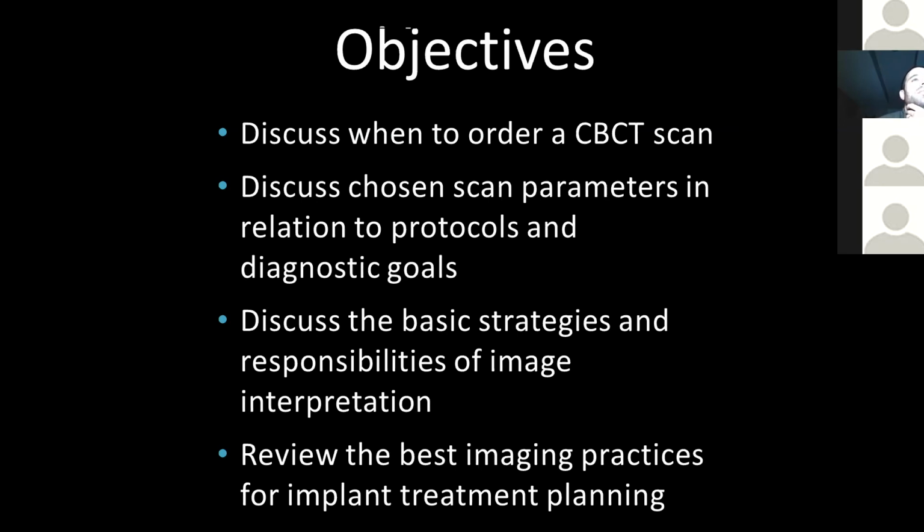There's software packages where you can do some really fun, interesting things where you can mimic or simulate the divergent beams in a traditional ceph, where one side of the face is slightly more magnified than the other. You can also eliminate that and basically create a perfectly ideal beam that eliminates that magnification. Either of those, it's fairly well documented that they are equivalent from a tracing perspective to a traditional ceph if you've created them properly. So they're just as good. You just have to have the software to do it.